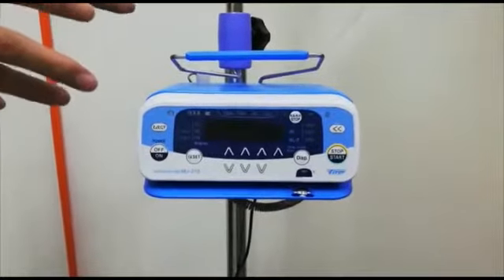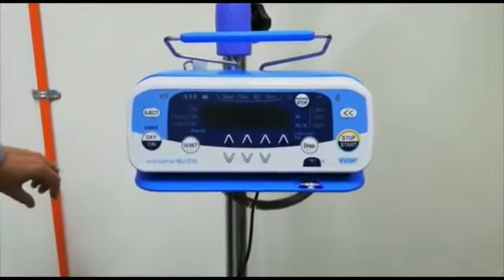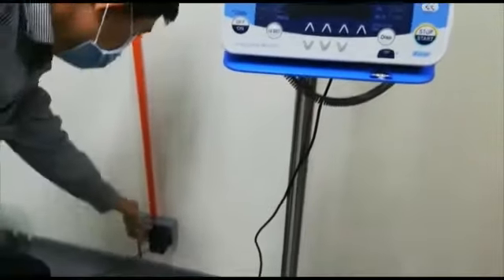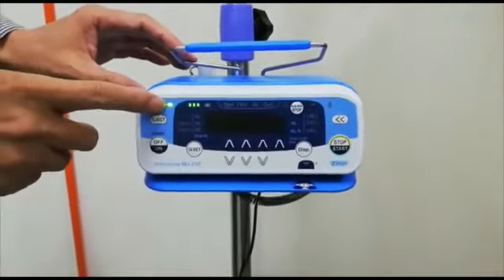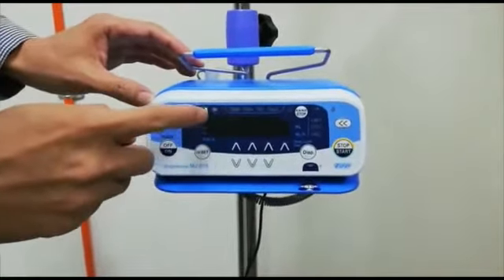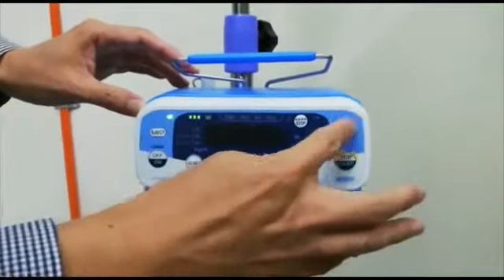I'll show you how to operate this pump. I already connected the AC adapter to this pump. I switch on now. You can see there's an indication here. There's AC power. The built-in battery is fully charged, that's why there are 3 bars. Okay, basically, this is the panel.